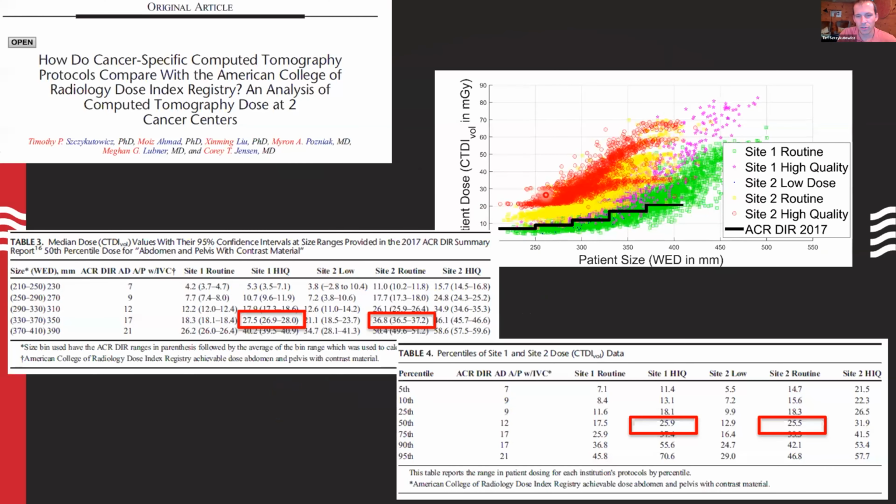Here, we actually noticed a fundamental shift between our patient size surrogates at MD Anderson and UW, even though we told the dose monitoring systems to tell us the same thing. So do I really trust that all the dose vendors are implementing all of these things the right way or in the same way? I know they're not. What I can trust, though, is that they are implementing them in some way that shows a monotonic increase: as patients get bigger, their metrics get bigger. As long as you're using some metric like that, that's what you need to care about when optimizing these parameters and looking for problem areas.